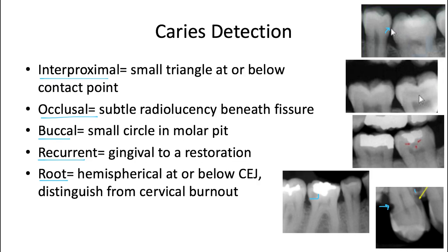With cervical burnout, you can still clearly trace the outline of the root. So unlike root caries where the root seems to disappear, with cervical burnout we can still trace it, and even though there's a shadow there, we can be confident that it is not a caries lesion.